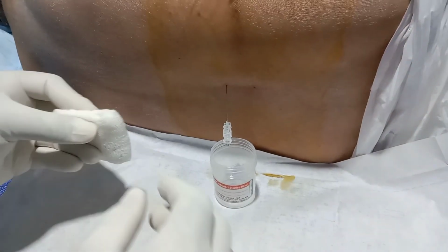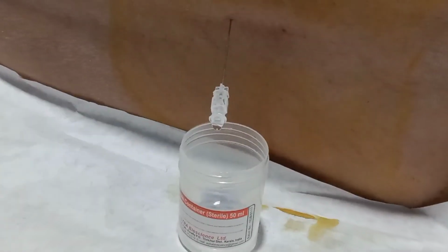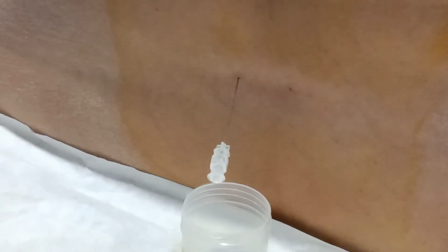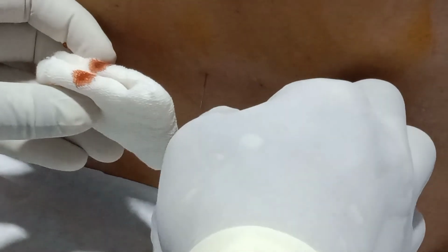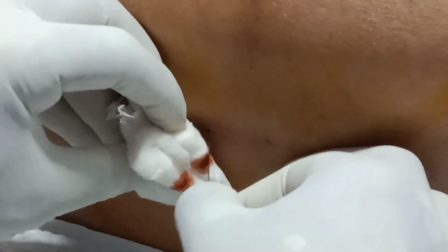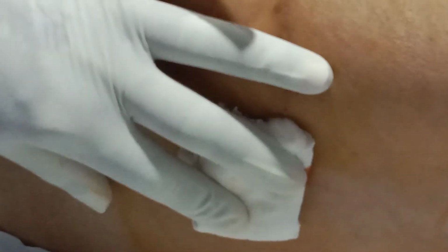Collecting the required amount of CSF fluid for analysis. So we have to take out the needle and close the site with a betadine gauze. Gentle removal of the spinal needle, and a pressure dressing should be applied over there.